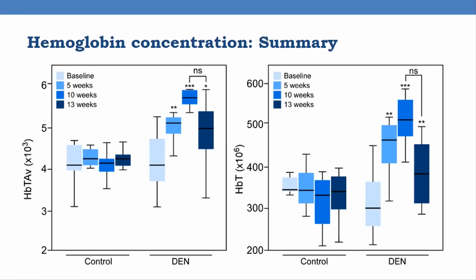So what does it mean? It means that in diseased liver, there is an inflammation. Inflammation leads to angiogenesis, and there's more blood flow in the diseased tissue. So that's why we are seeing a marked increase in photoacoustic signal.